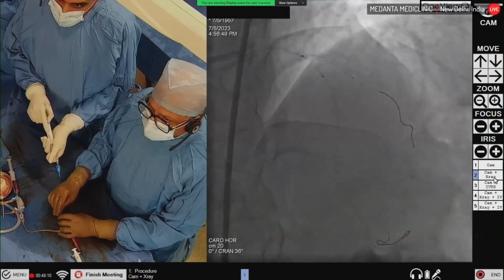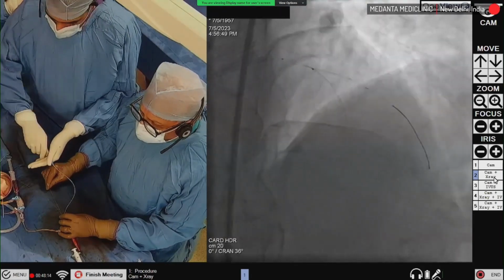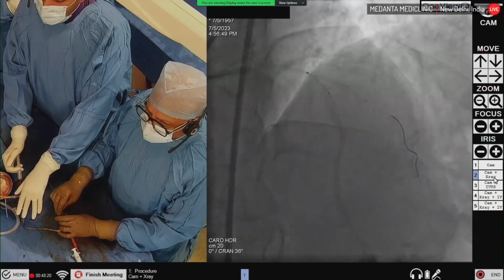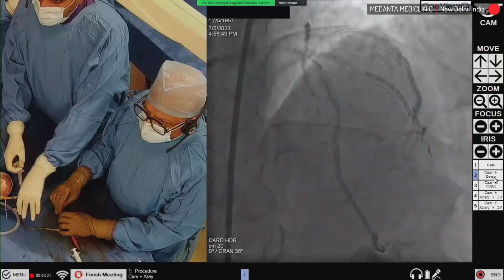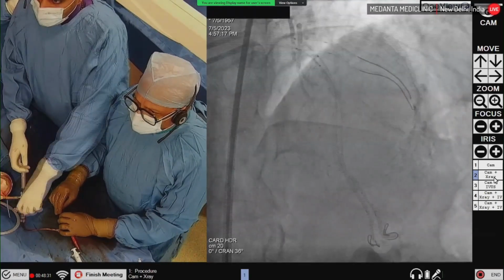Okay. Please connect now. Check, please. Okay.